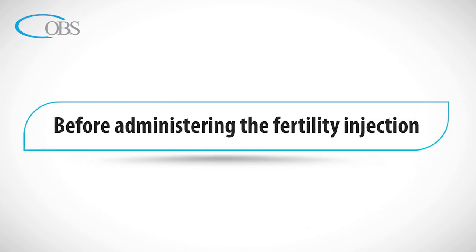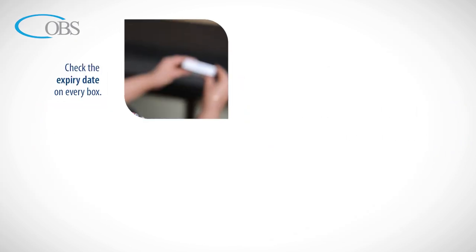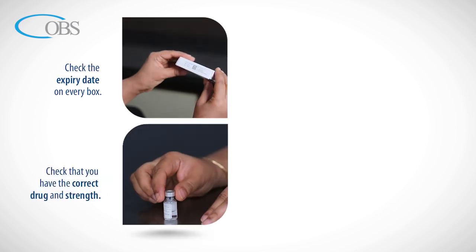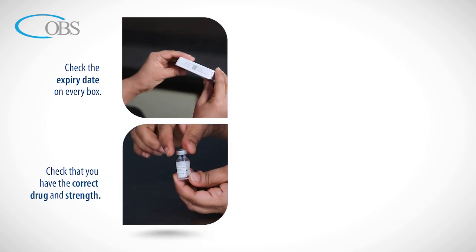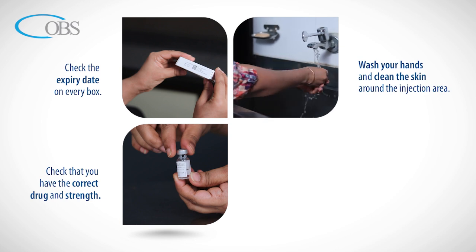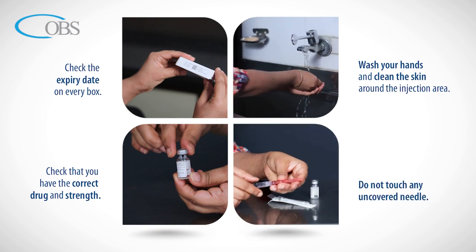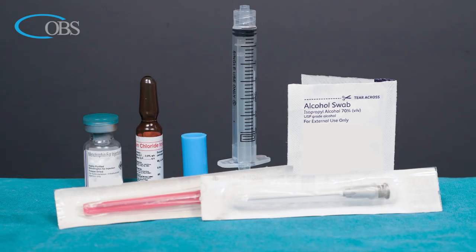Before administering the fertility injection, check the expiry date on every box. Check that you have the correct drug and strength. Wash your hands and clean the skin around the injection area. Do not touch any uncovered needle.